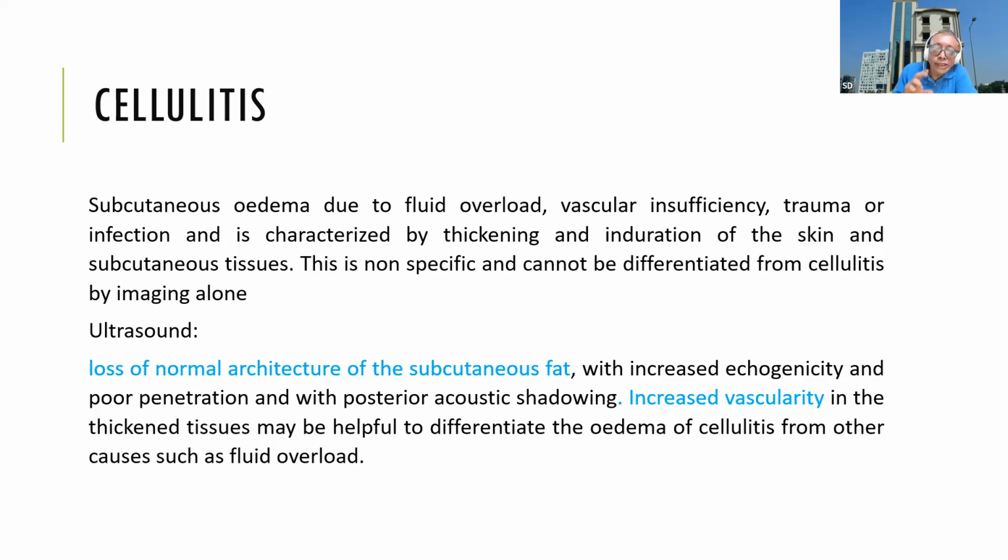But if you put an ultrasound probe where there is subcutaneous edema, and there is increased vascularity, this is a sign of cellulitis or some infection. If you just see an increase in subcutaneous edema, it can be due to fluid overload, vascular insufficiency, or acute inflammation following trauma.